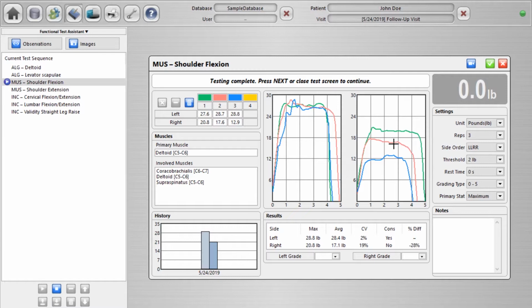First of all, you wouldn't be collecting successive repetitions because you would give your assessment simply after the first resistance test or something like that. But here, when we were chasing coefficient of variation, we wanted to show consistency, show that we had collected multiple repetitions and therefore had a pretty good sense of the repetitions overall. Well, we can see that the coefficient of variation has jumped up to 19% for our right-hand side.